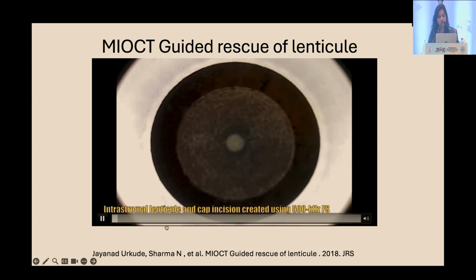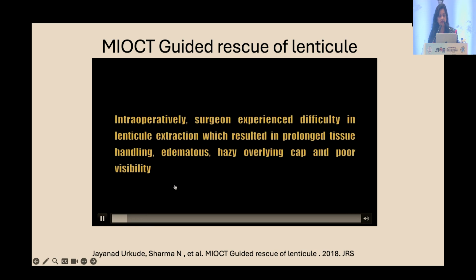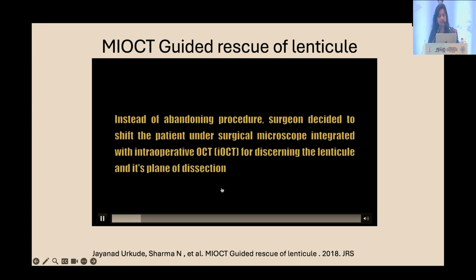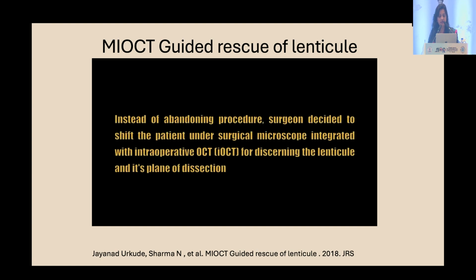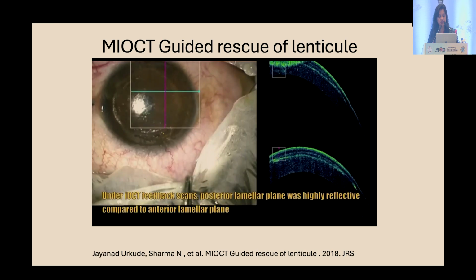Now, this was our case in which there was a retained lenticule, and intraoperatively there was some difficulty in the lenticular extraction which resulted in prolonged tissue handling, and the cornea became hazy and edematous. So instead of abandoning the procedure, it was decided to shift the patient from the surgical microscope to the intraop OCT microscope.